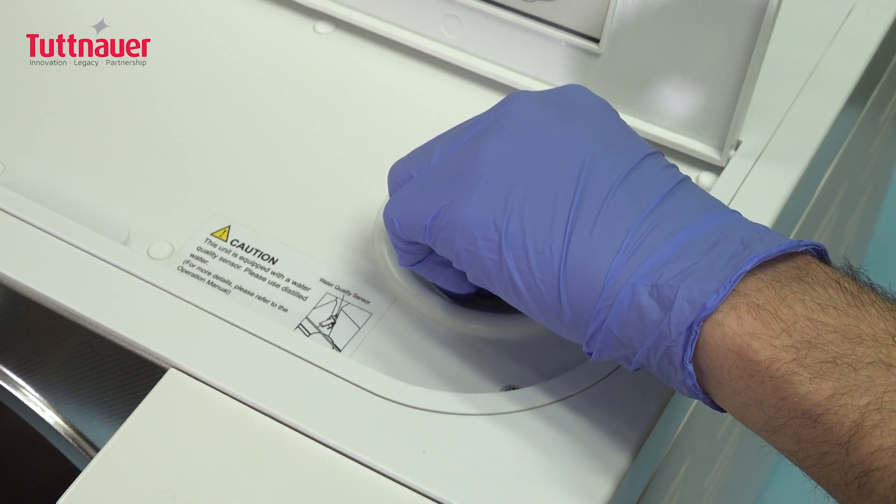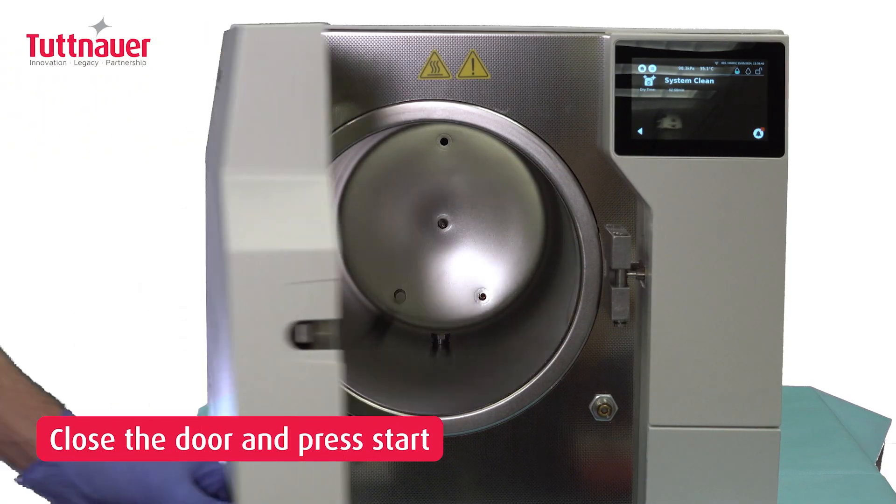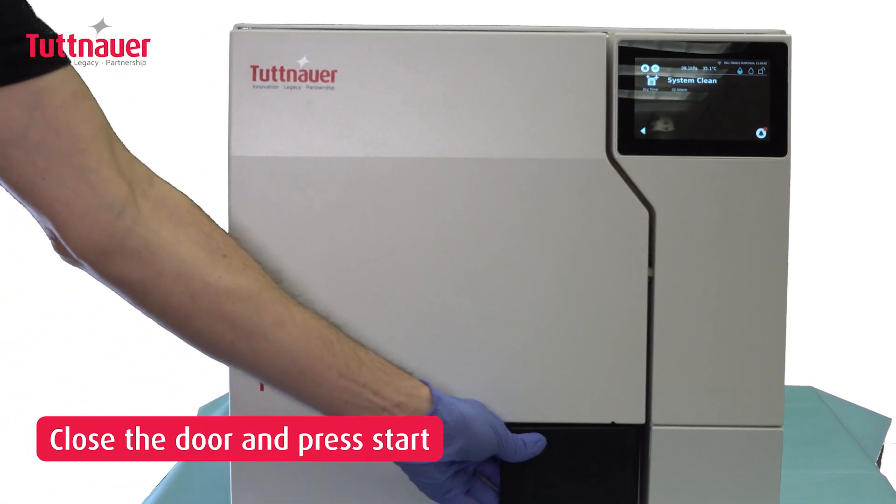Replace the filter and close the lid securely. Close the door and press the Start button to initiate cleaning.